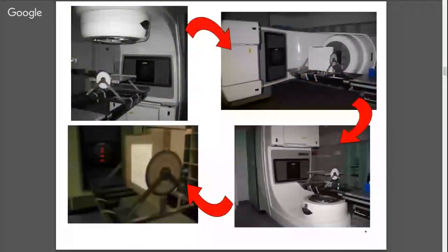So there we are doing it at different angles. On the left is at 0 degrees, so the beam coming from the anterior direction, and then we'll do some laterals. We can also check it from 180 and also from the 270. And this is really just checking that collimators and things don't move and the light field doesn't change as we rotate the gantry around, and we get some sagging effects maybe.